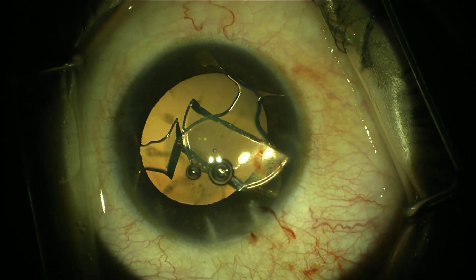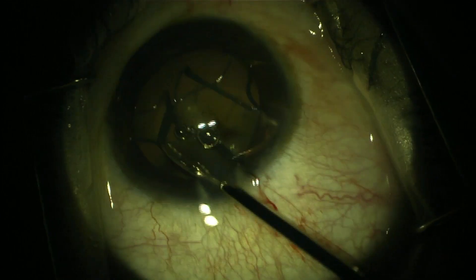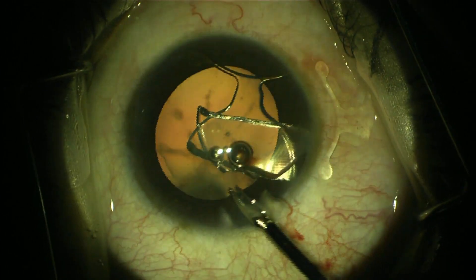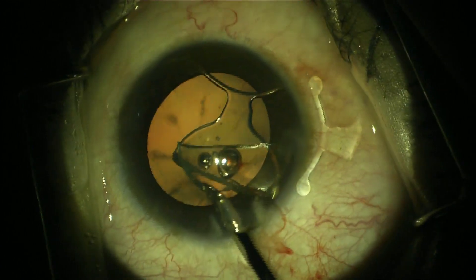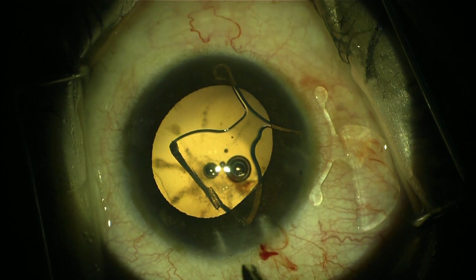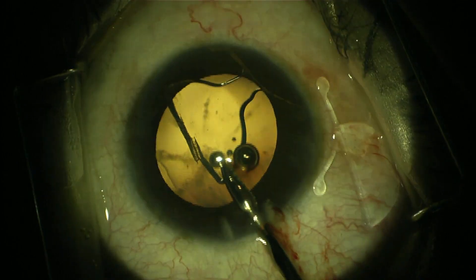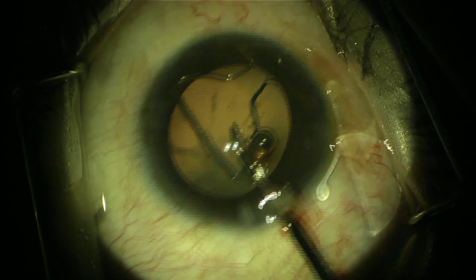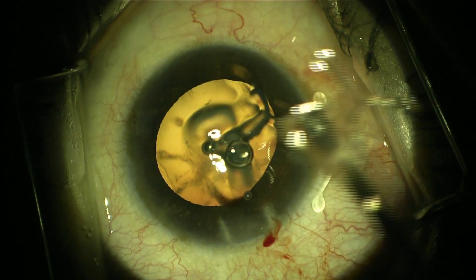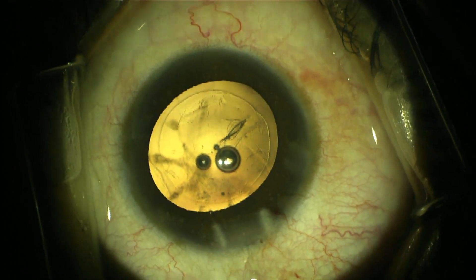It is very important in these steps to avoid any endothelium touch by the pieces of the IOL. Because the lens is foldable, it was easy to remove the pieces from the anterior chamber. After removing the phakic IOL, I proceeded with regular phacoemulsification.